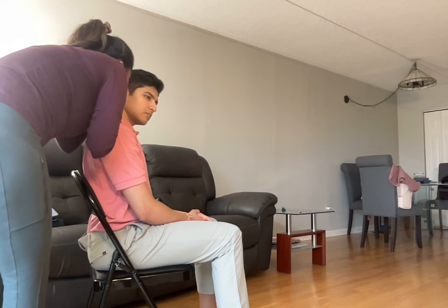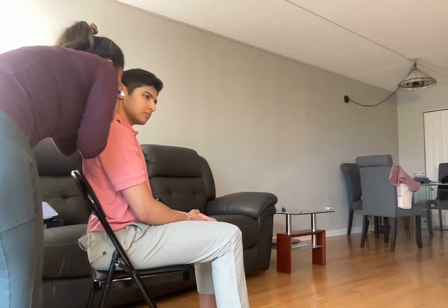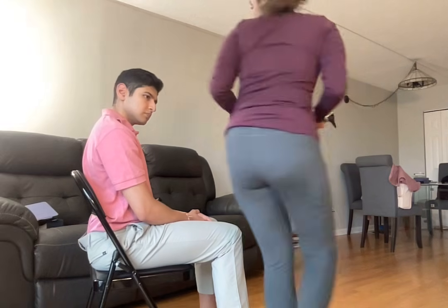All right, I am looking into the tympanic membrane and ear canal. There is no occlusion, no foreign object. I can see the pearly gray tympanic membrane, no bleeding, no swelling, no discharge, no purulent discharge or drainage. All right, tympanic membrane intact.